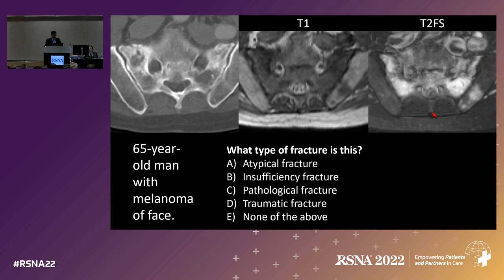All right, so what kind of fracture was this one? These were insufficiency fractures, pretty straightforward on the initial. The follow-up was the one that confused people with the developing quote-unquote lesions, which were just areas of fat necrosis. So just be aware of this so you don't get fooled. And we think the same thing was happening in the posterior ilium as well.